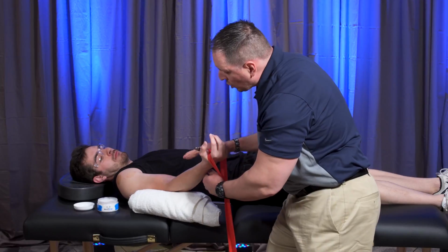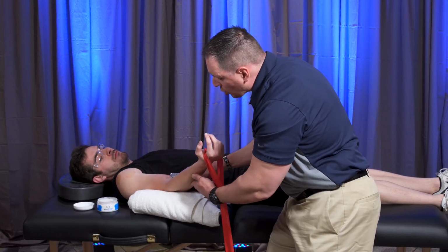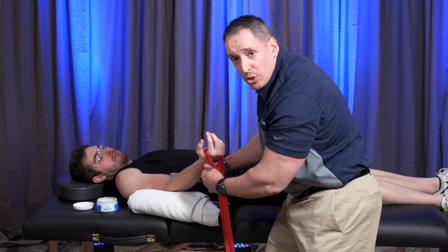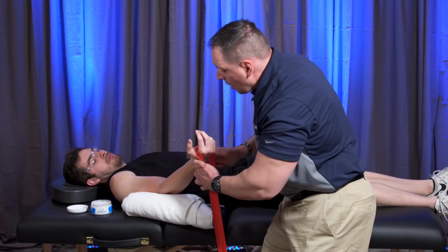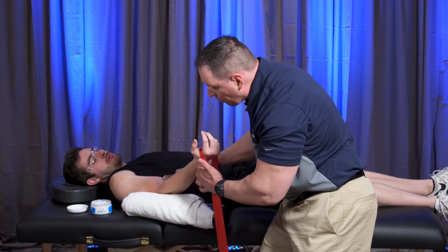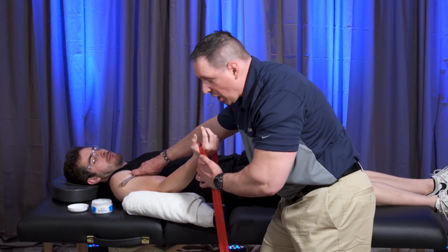And so now, instead of using my fingers, I'm able to use the concavity and the convexity of the instrument in order to get a nice surface area. So now I have more real estate in contact with the patient. So now I'll go both directions due to the double beveled edge, work a little here and back in the opposite direction right up the chain.